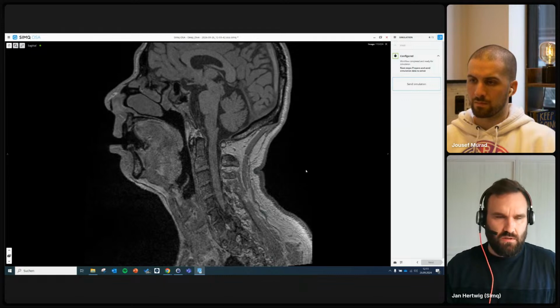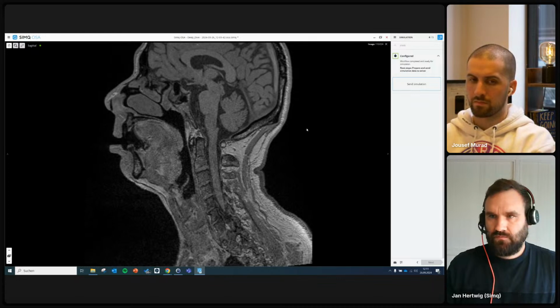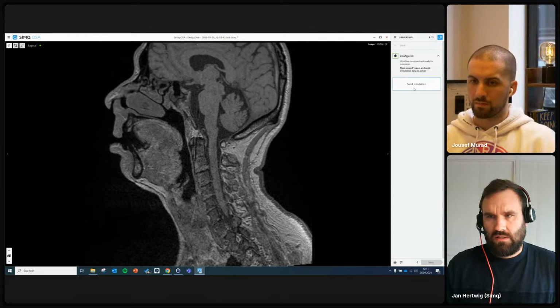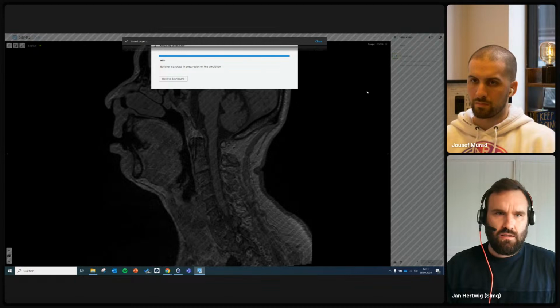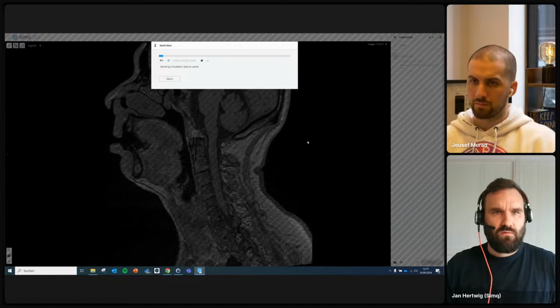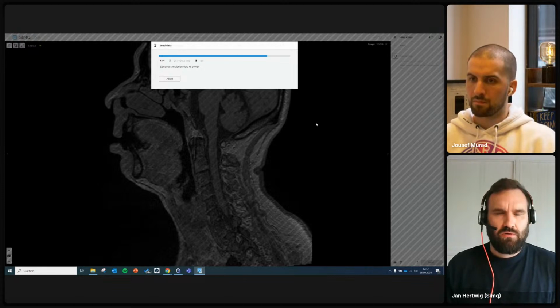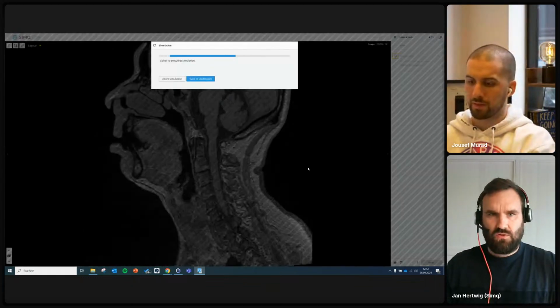After that, we're done. The simulation is set up, so that's really easy. Pretty much everybody can do it very fast and easy to use. After we did that, we can just click on send simulation. And if it's configured, you can send it. And the simulation is sent to our cloud. Once saved, the data are uploaded, encrypted, and sent to the backend.